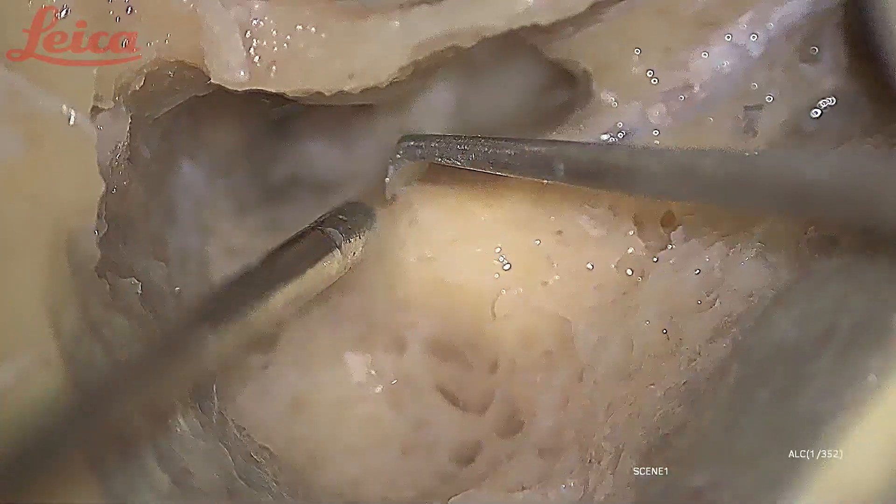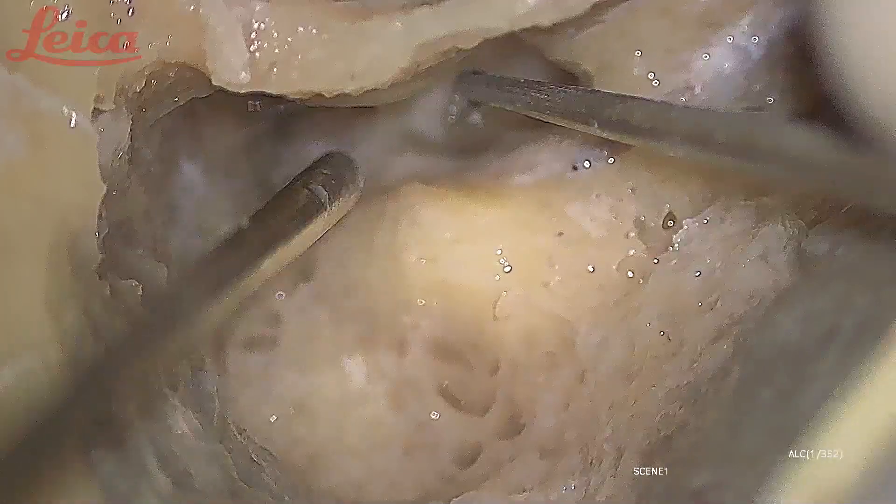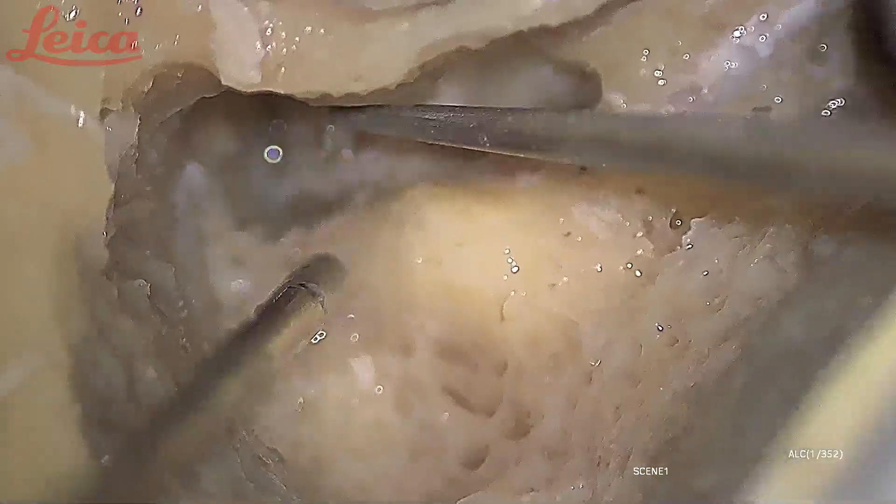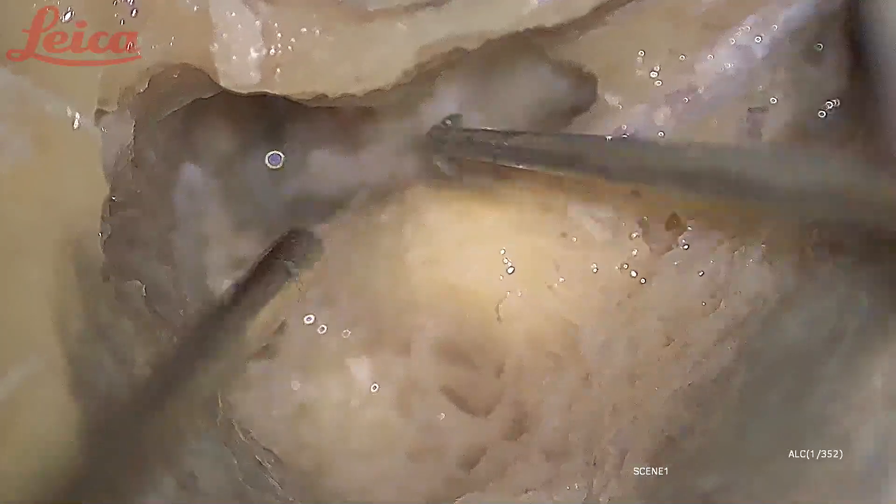What is the Barber-pole technique? When you are drilling the vertical segment of the facial nerve, you always drill posteriorly to avoid damage to the chorda tympani. Near the second genu, you have to work laterally so you don't damage the lateral semicircular canal or the stapes. When you go to the horizontal segment, you have to work inferiorly to avoid damage to the lateral semicircular canal. This change in direction of your bird tip in different segments during decompression of the facial nerve is called the Barber-pole technique — it is to avoid damage to critical structures while delineating the facial nerve.